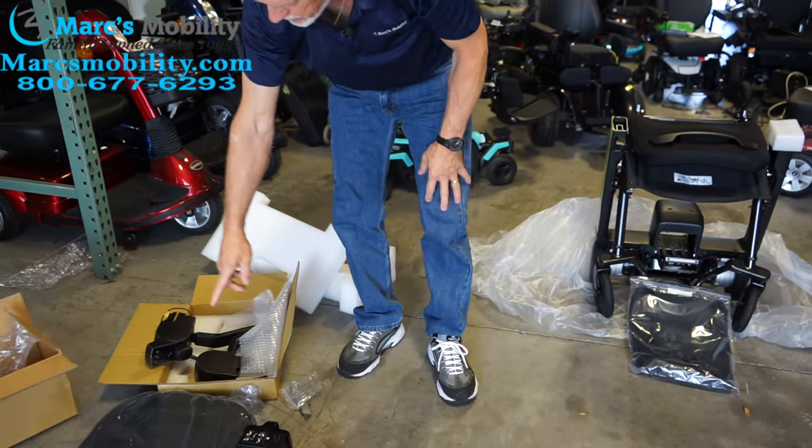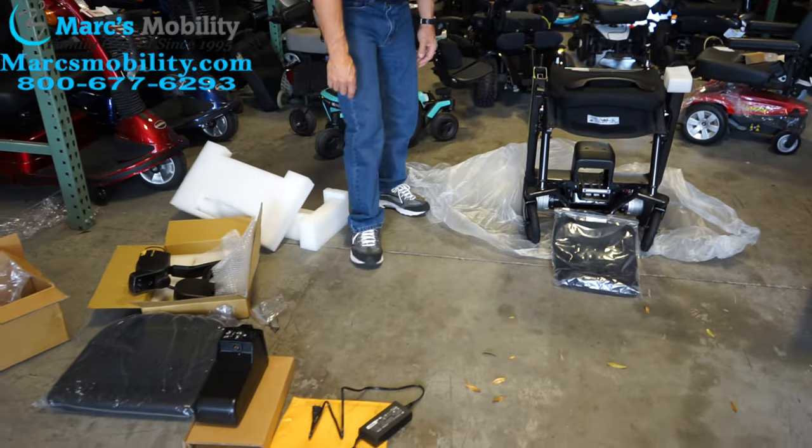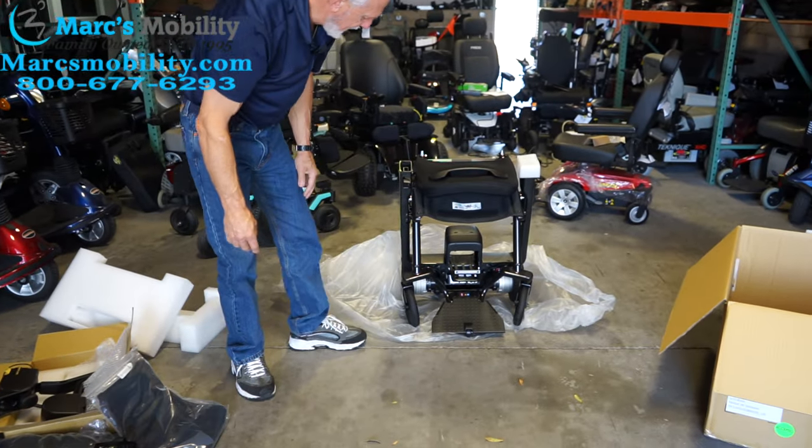Now we've got the cushion, the armrest, the joystick, the charger, and that. So let's just get this out of the way.